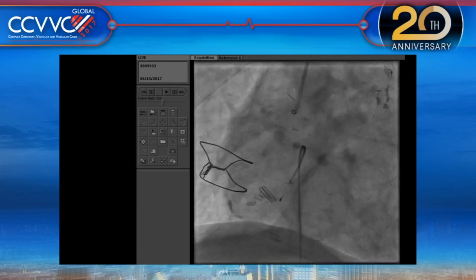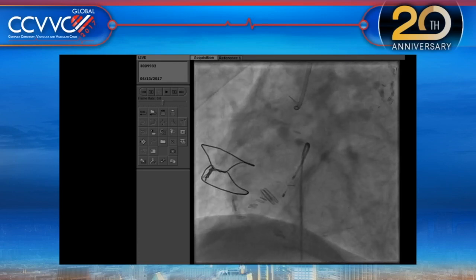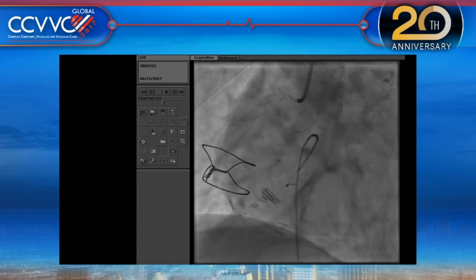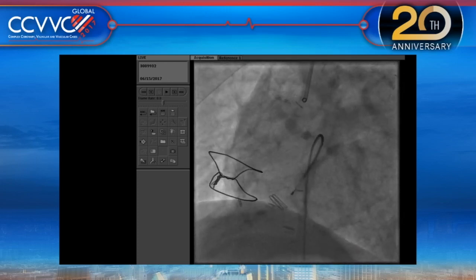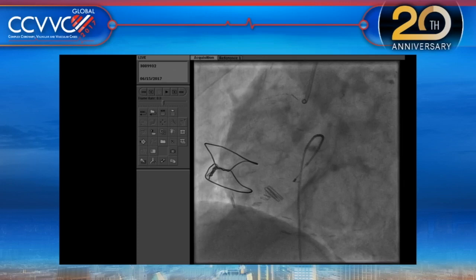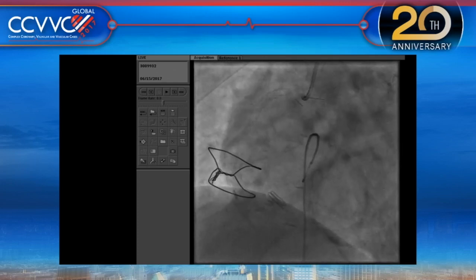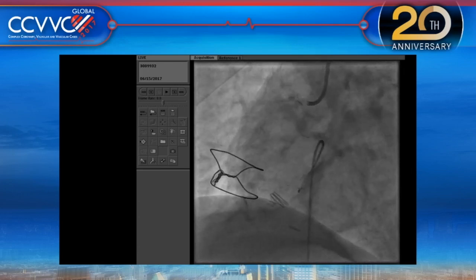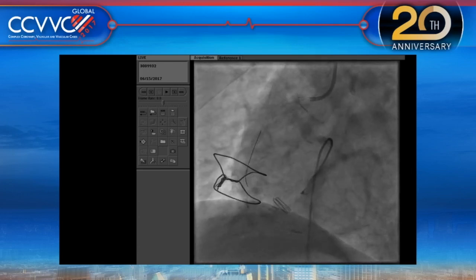Yeah, another guide would be, I would say, the no torque, or the 3DRC. That's again notorious for not having back support. Big trouble with the support. But with more support, the risk also is to damage the part of the stent which is inside the aorta. So it's a very complex procedure when you have no support because of the stent outside, and that makes our life complicated.